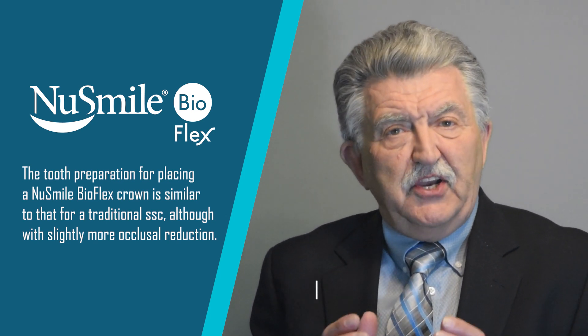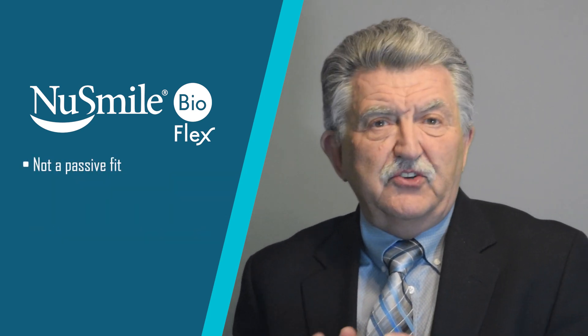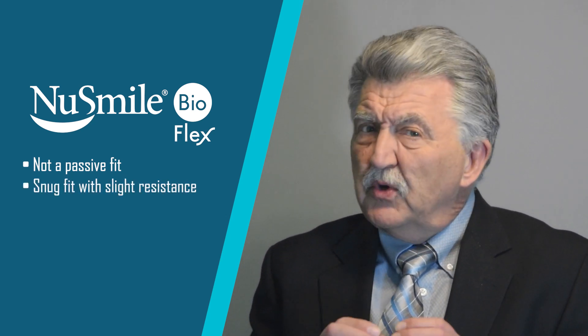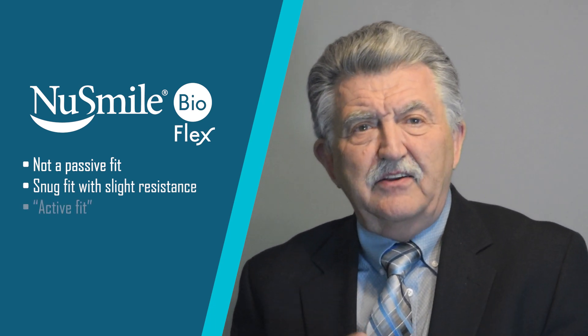The feel of placing a New Smile BioFlex crown is not the passive fit that's required for zirconia or pre-veneered crowns, but instead it's a snug fit to the tooth with slight resistance. I would describe this as an active fit.